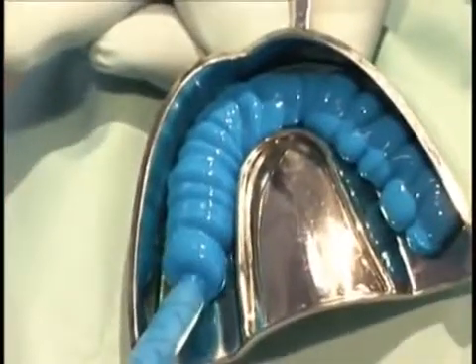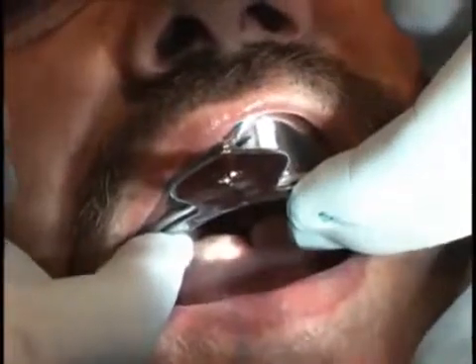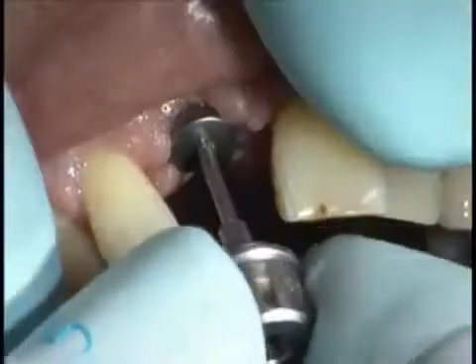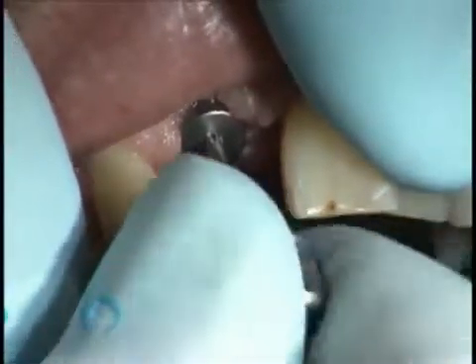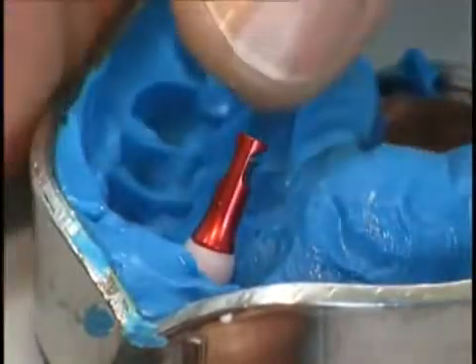The impression is taken using a custom impression tray and an elastomeric impression material. This is the completed impression with the impression coping and positioning cylinder in place. The implant is now once again closed using the SCS healing cap, and the temporary restoration is inserted. At the dental laboratory, the corresponding implant analog is repositioned in the impression. The shoulder must snap firmly in place.